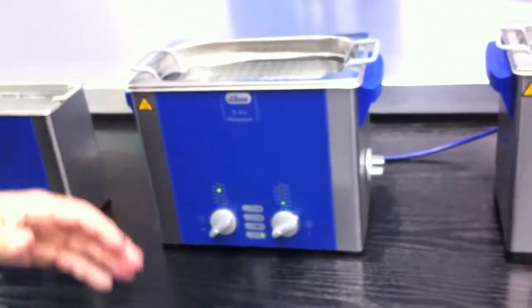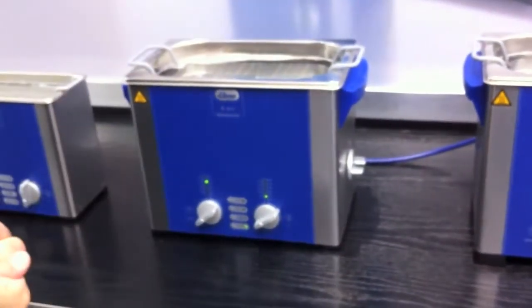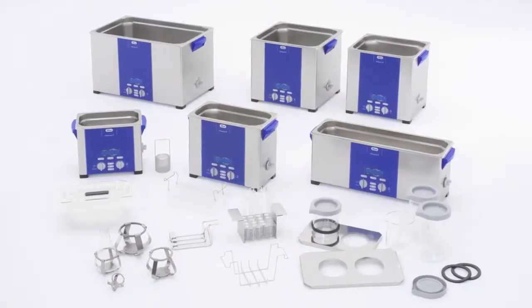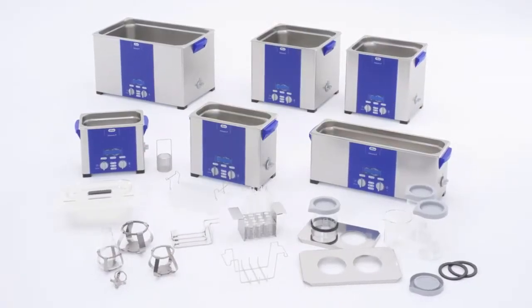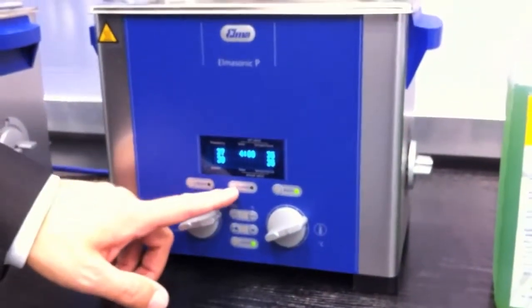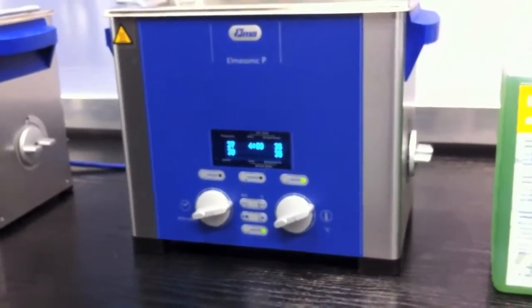We have three liter models, which is the machine often required in the dental market, and also a new technology based on the professional line, which contains different frequencies, power regulation, pulse function, and many other attractive options.